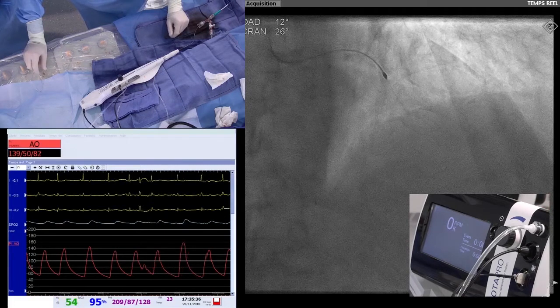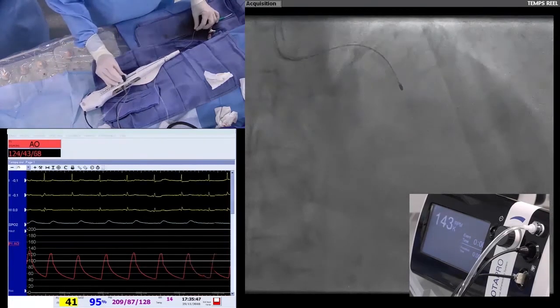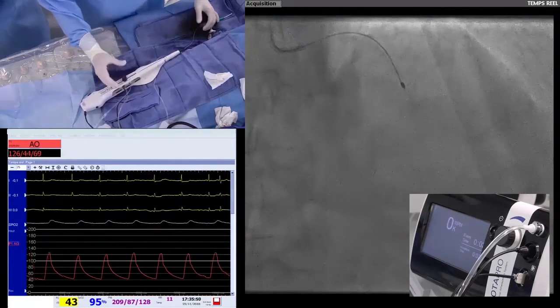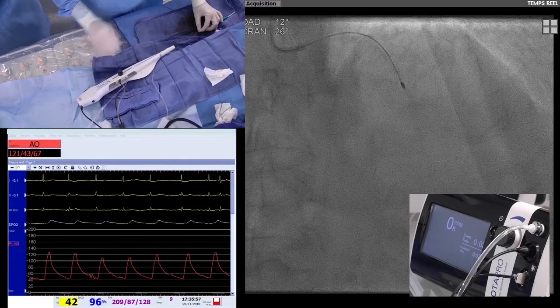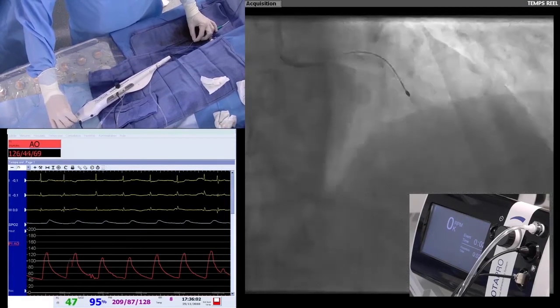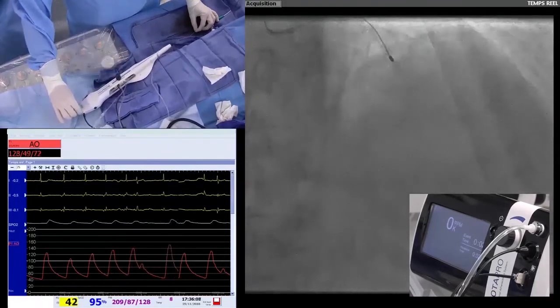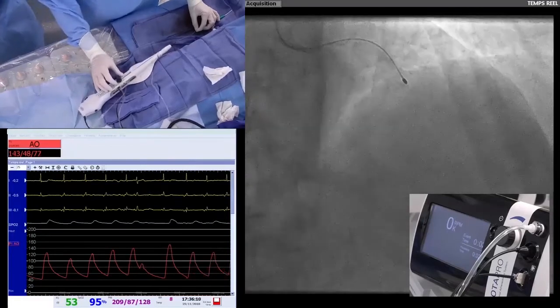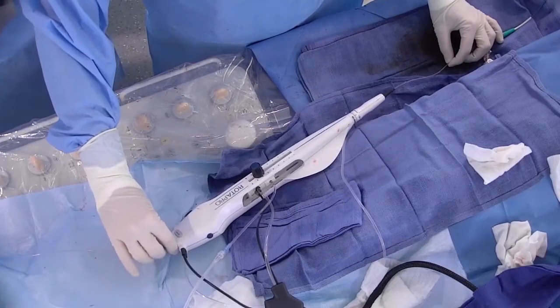No, it's a big change, isn't it? It's okay. Yeah. Maybe I can show you how to advance the burr more distally if you want. Yes, that'll be a nice thing to see. So I start to advance it. I stop. I am in this part. With my left hand, I will block the shaft of the burr, and with my right hand, I will pull the wire, which is quite distal, and you will see the knob, the molette in French. I don't know the word in English. Sorry. The knob will go more distally.